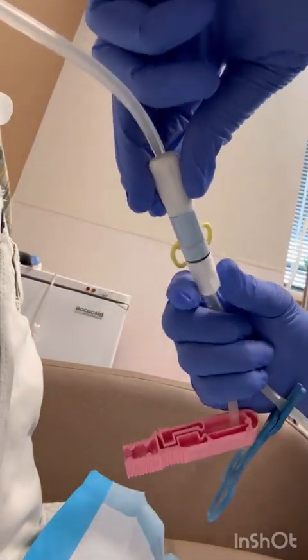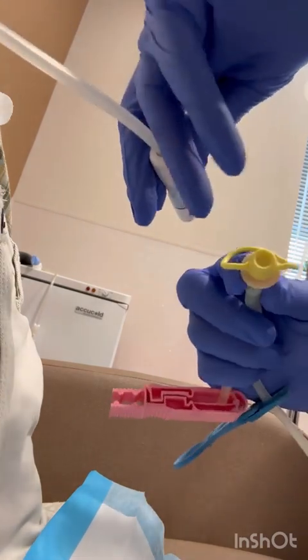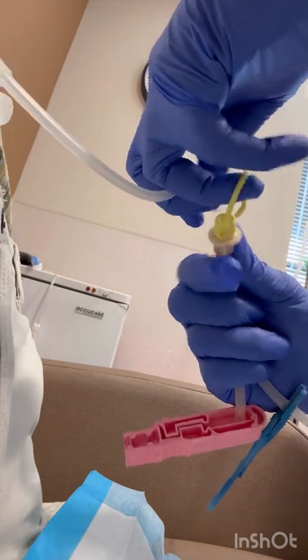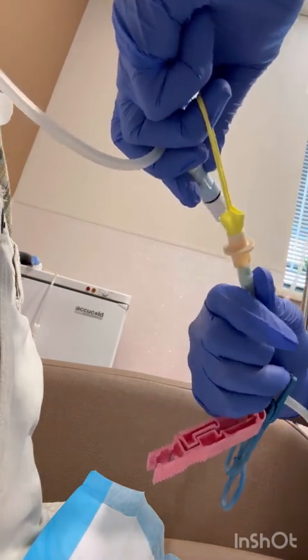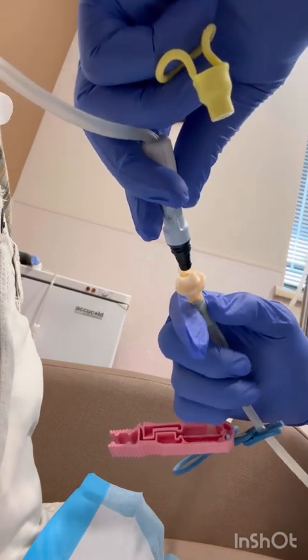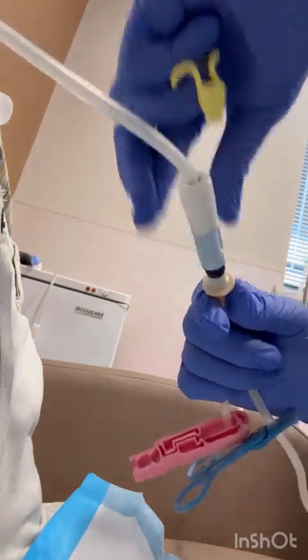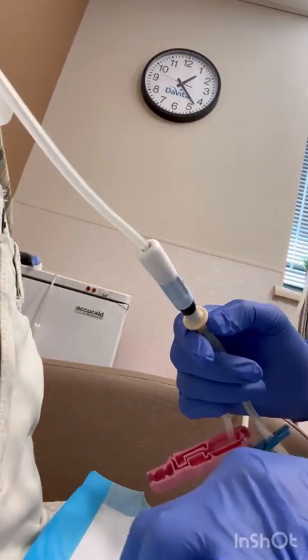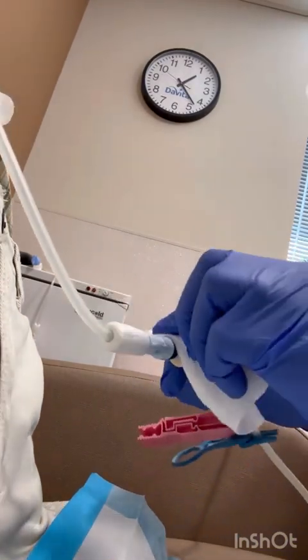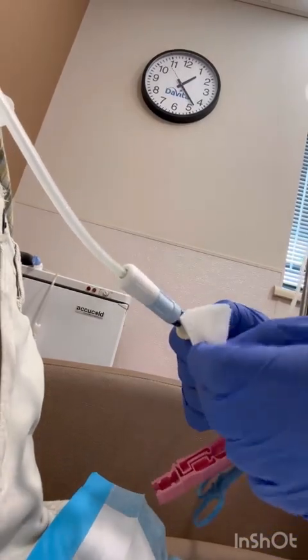Pull off that piece of gauze. Loosen that transfer cap — that mini cap. Put the ring on the finger and pull. That mini cap's already loosened, so just let it fall down and twist, twist, twist. Connect it. Now take that gauze and wipe off the iodine, because that's how Steve's pants got dirty — he didn't wipe off the iodine.